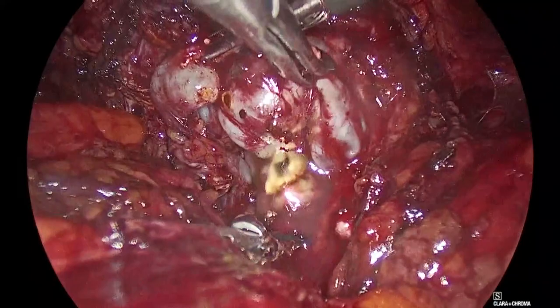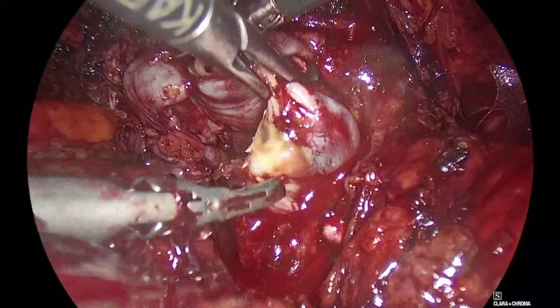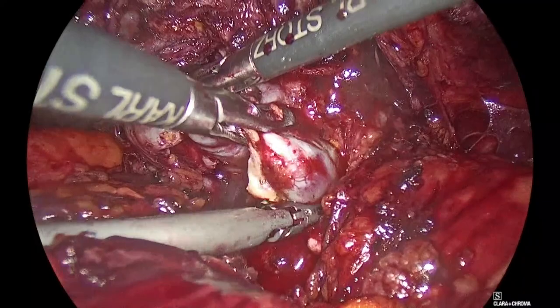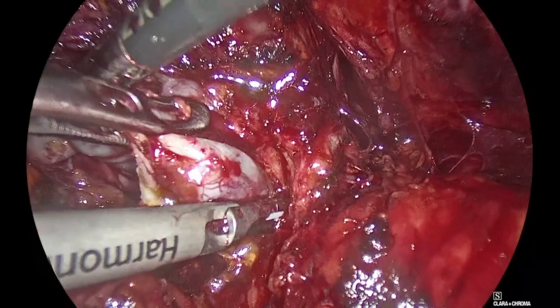So this is nice fluid. Big seminal vesicle here. Show me in, Padeli, in. As I told you, the trickiest part of this operation, I think, is the posterior part. Once you reach the point we are now, take some time. No matter how big the prostate is, it's what you do in the posterior layer of the prostate that really counts for me. Come closer. Good.